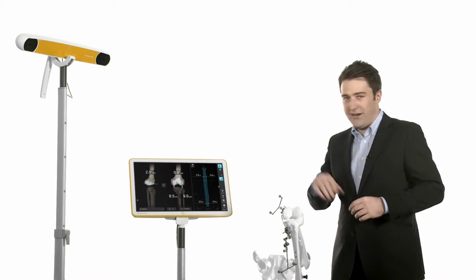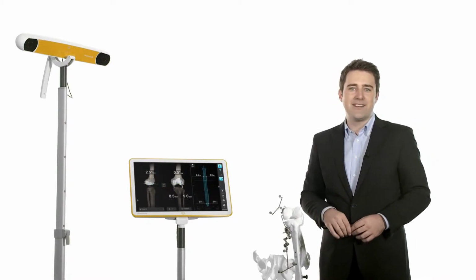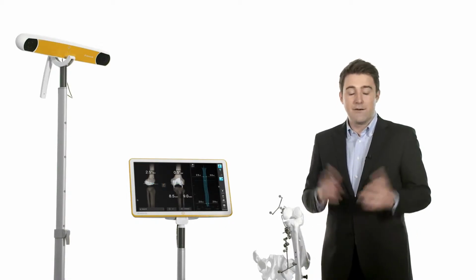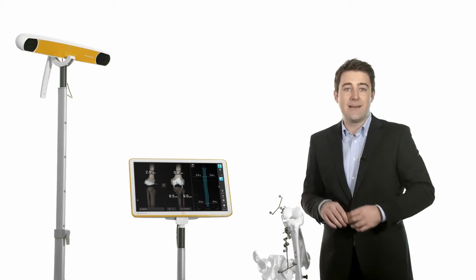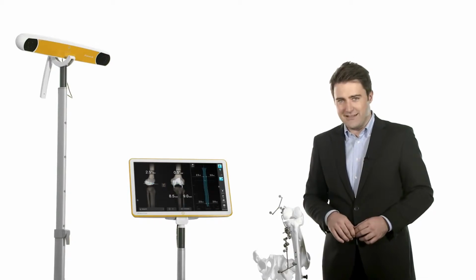This is Knee 3. Knee 3 is a completely new software that takes a different approach to addressing the current challenges of navigated total knee replacement. For the first time, BrainLab presents a knee navigation software that visualizes joint stability over the full range of motion, allowing the surgeon to examine kinematic movement of the knee joint before any resection has been made.